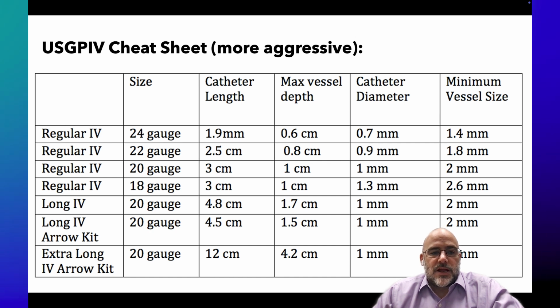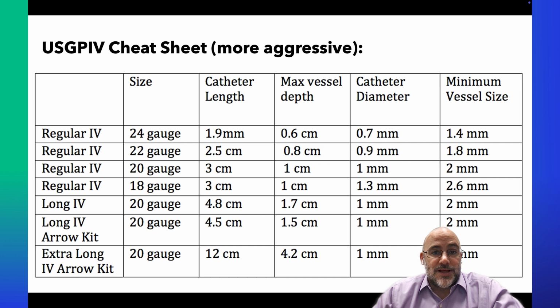But the important thing to recognize is that if you're looking at anything around the 1 centimeter mark or so, you're going to be thinking about something that tends to be a non-standard catheter length in most EDs.